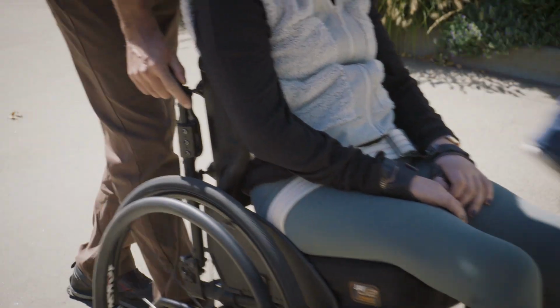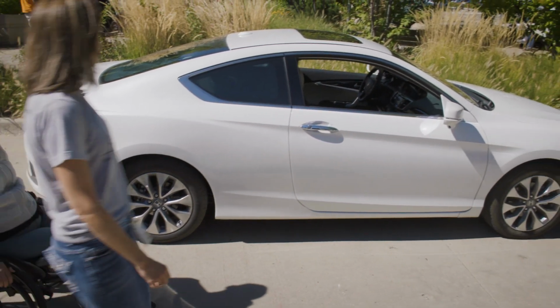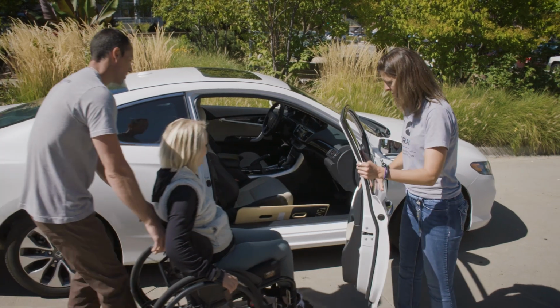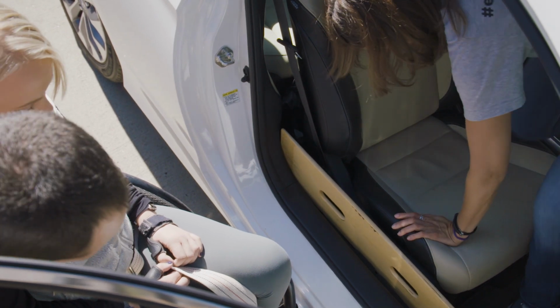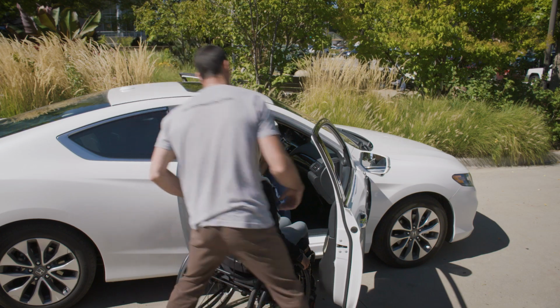Normally, you will want the car seat as far back as possible, although this will vary between door frames and vehicle models. Set the wheelchair at an approximate 30-degree angle. The front of the big wheel must be even with the door frame. Lock all brakes and ensure casters are set forward.